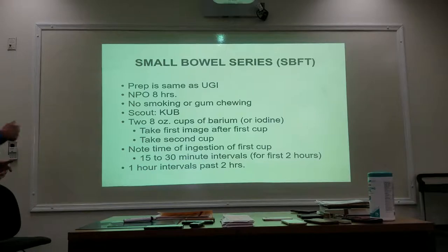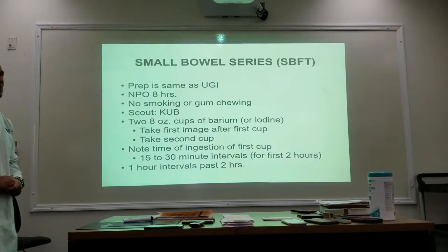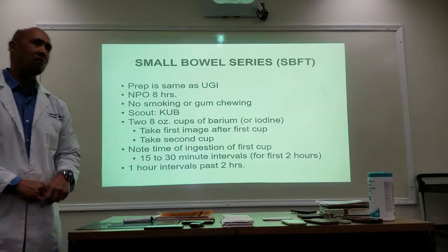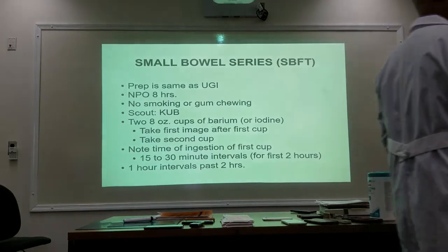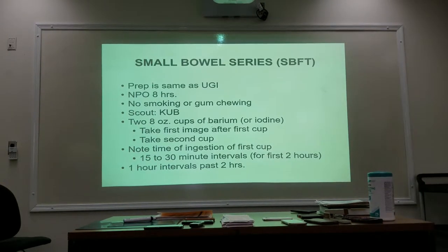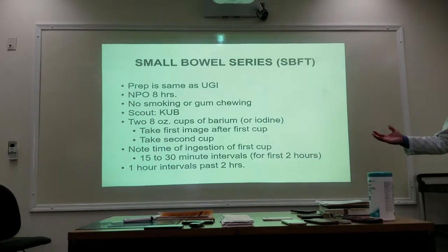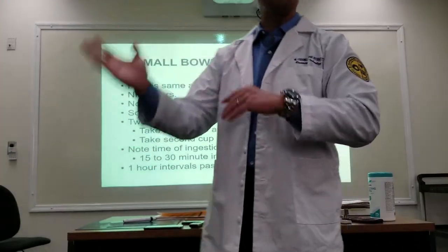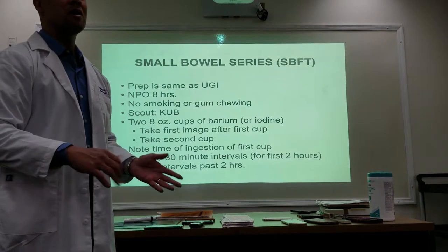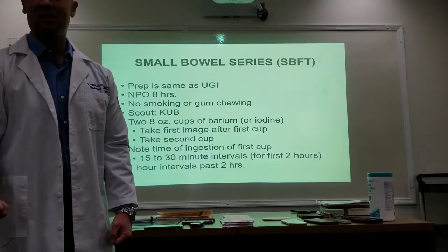Okay. And again, in between shots, have your patient walk around. What if the patient can't stand up? What if they can't walk around? Going back to your question, well, they'll just be seated. Okay. Well, what we're going to do is, our fluoroscopic units, the table, has the capability to be tilted up. So we're going to put them in an RPO position.